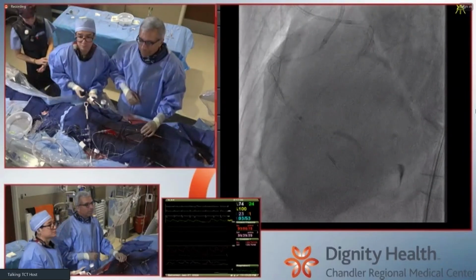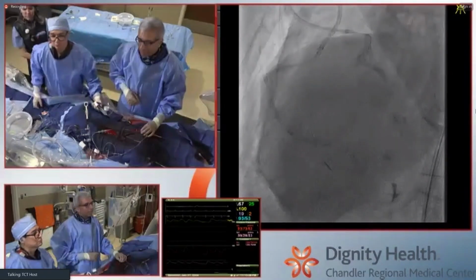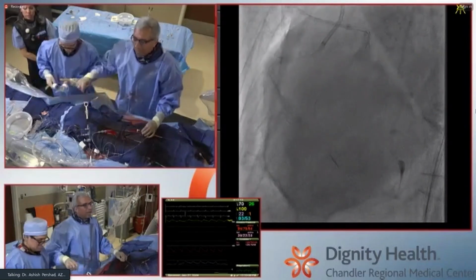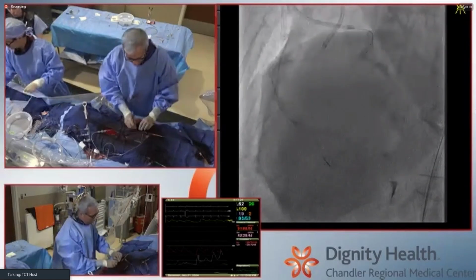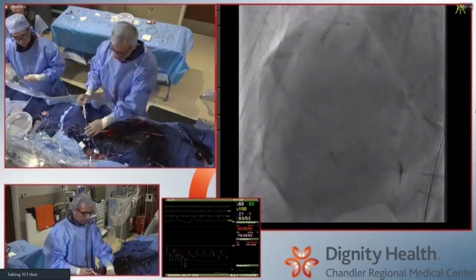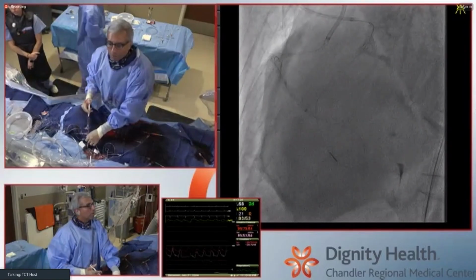So we are covering the entry site of the distal hematoma, right? Yeah. Even after this, the distal looks small. It's okay because the hematoma extends. Yeah, it'll grow, correct. That's why he took the 2.5 balloon up front, to try to decompress and cover the entry site. And in the first picture the very distal vessel is super normal, so I think it should heal. Yeah, that's great.